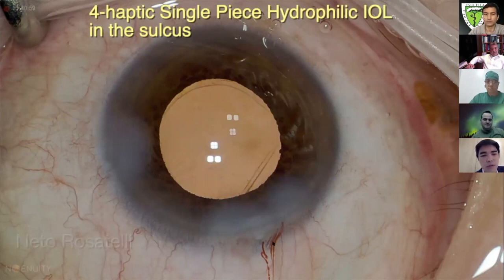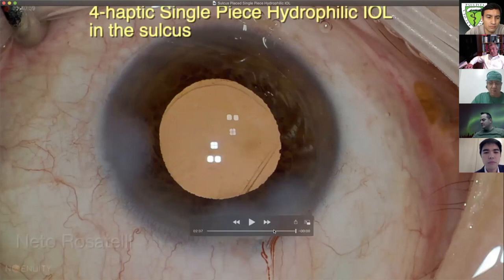I would also ask if you could, I don't know if you're going to say it in your presentation, but if you could show us the exact moment and freeze the frame where you noticed there was a tear. I noticed just at the end of the epinucleus aspiration, and I couldn't see, even reviewing the video afterwards, the exact moment it happened.